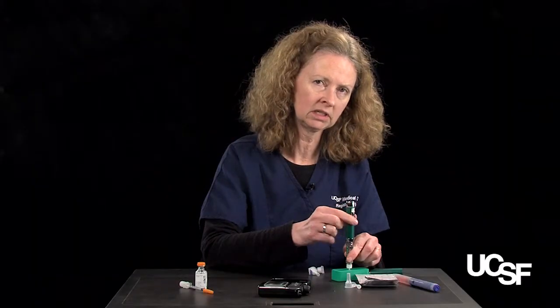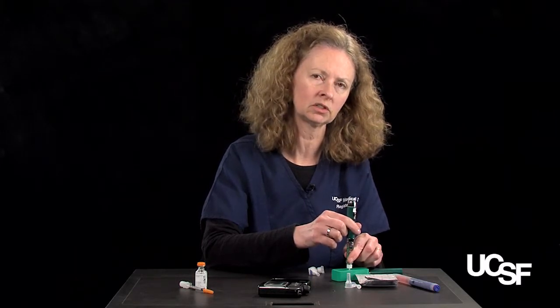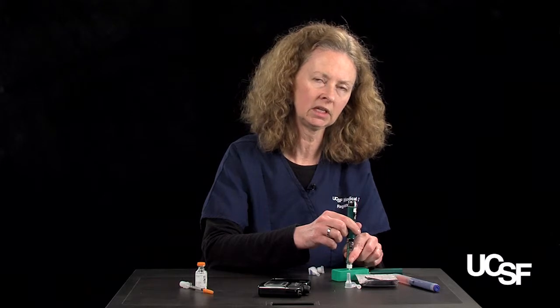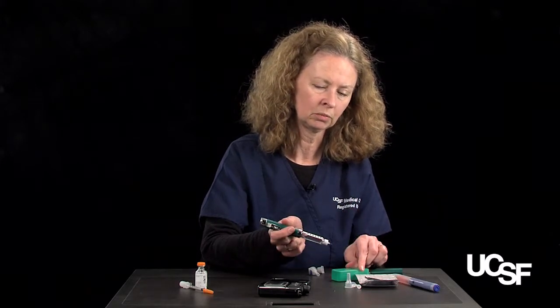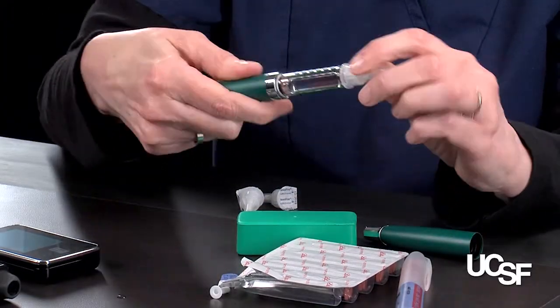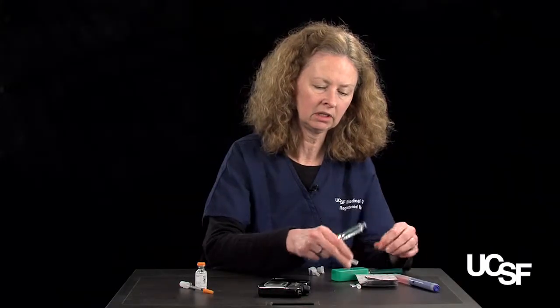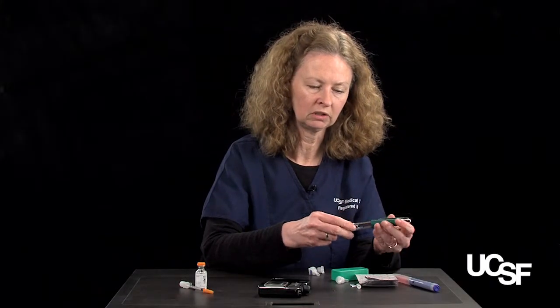And the reason that we count to 10 is that the insulin pens deliver the insulin a little bit slower than a syringe does, and we don't want that insulin to leak from the site. So after we've counted to 10, we can pull the needle out, we can cap that needle and remove it. So that pen is now ready to go for the next meal.